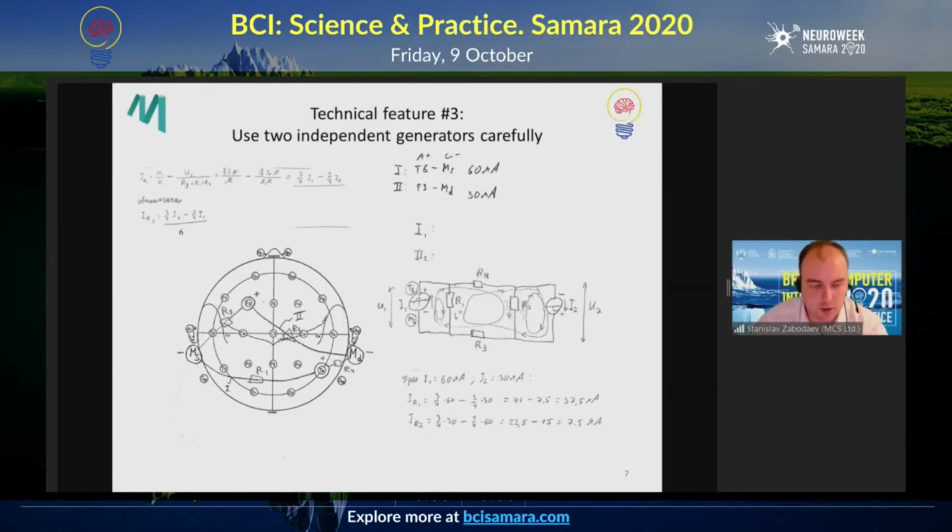The sensor will show you that there is a current flow and it will seem fine on the surface, but what will happen in reality is the redistribution of the current. And this redistribution of the current will be completely unpredictable. For instance, the first generator will generate the current for the electrode above it, and some of the current will be directed elsewhere.